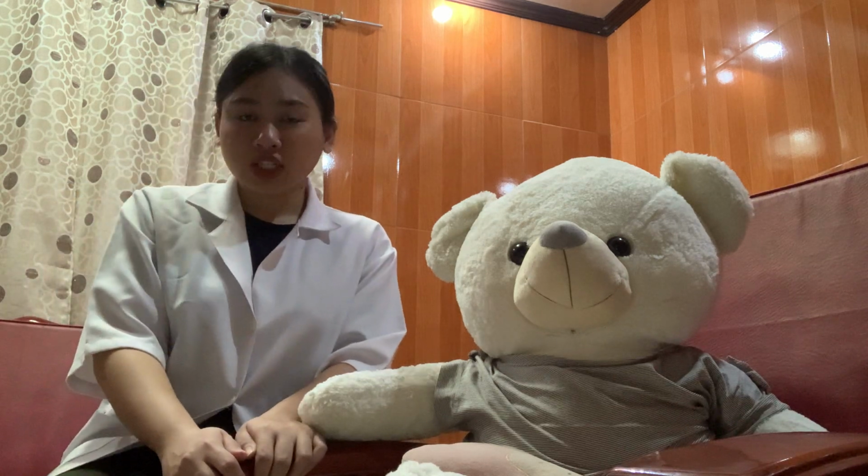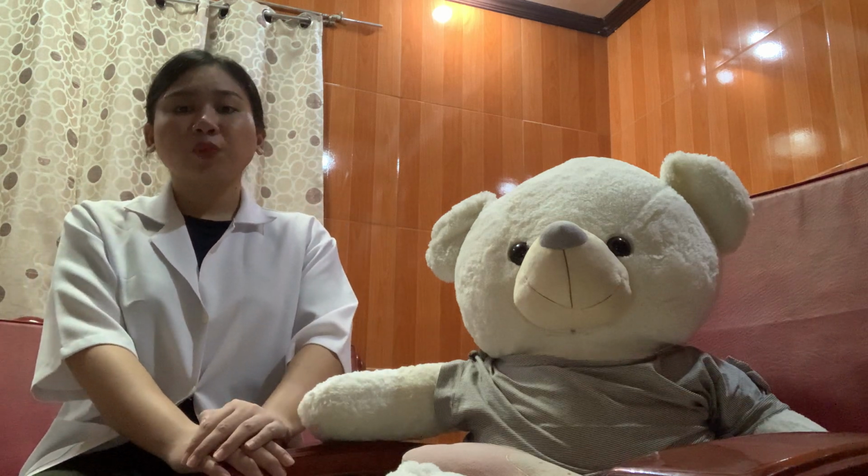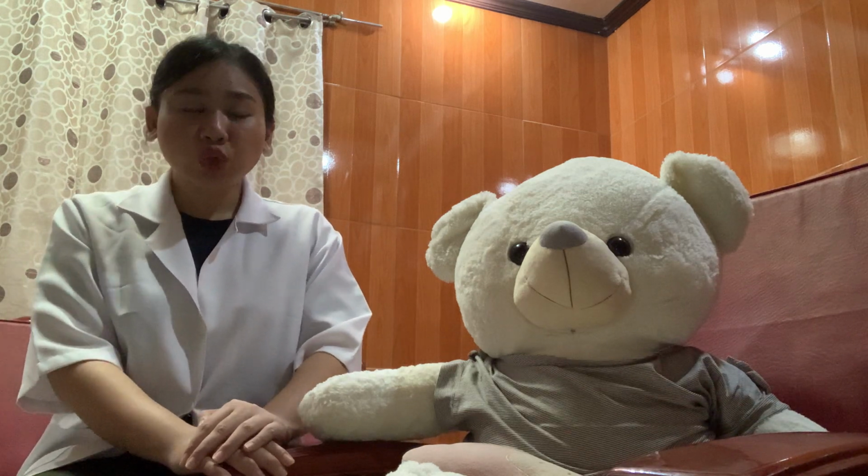So first thing we need to do is the hand washing. This reduces the number of microorganisms residing on the surface of our hands. After that, we read the doctor's order. This is to obtain pertinent data, and then we instruct the patient regarding the purposes, procedure, and responsibilities. This information may alleviate hyperventilation. When it is present, it may alter the arterial blood gas values.